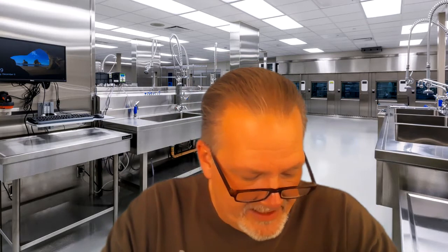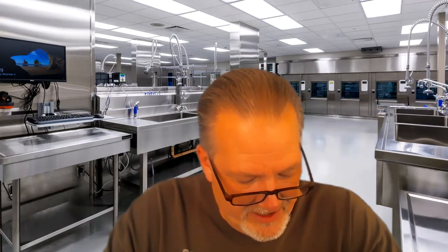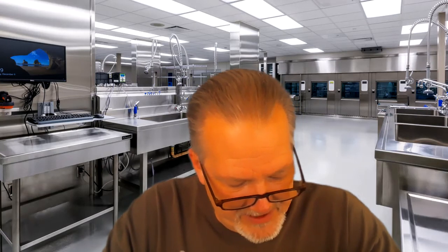Some safety guidelines for soiled item transport. All instruments, utensils, and equipment used in patient care and treatment processes should be considered contaminated. And it doesn't matter if it doesn't look contaminated. It doesn't matter if it doesn't look like they used it. Consider it to be contaminated. It was dispensed for patient care. It's coming back to us. We're going to put it through the cleaning process according to the instructions we used from the manufacturer.